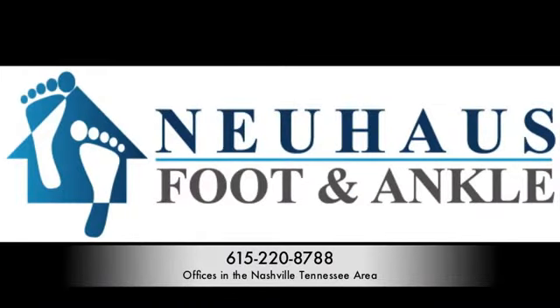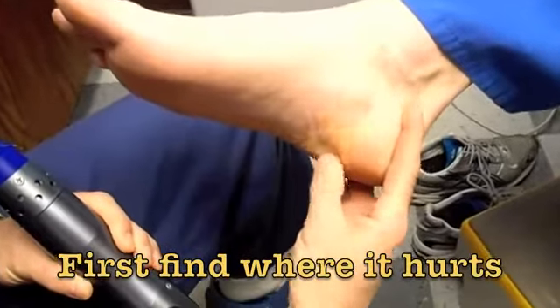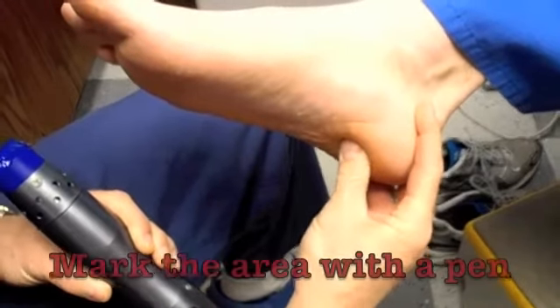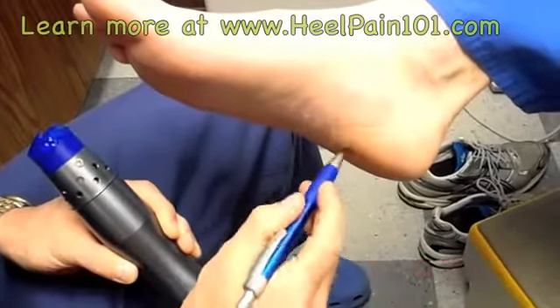Because it's non-invasive and there's very little downtime, you essentially keep up with your normal activities. The way it works, we find the area where it hurts. The maximum point of tenderness is typically the insertion of the plantar fascia into the heel bone. We mark this area with an X.